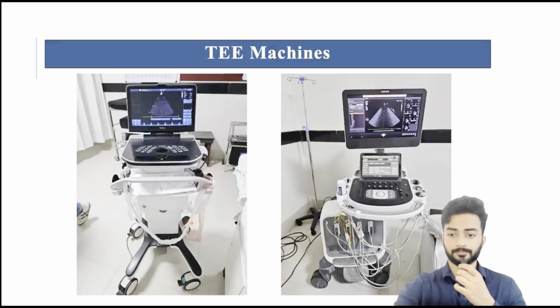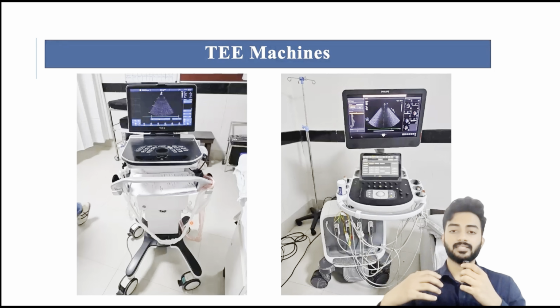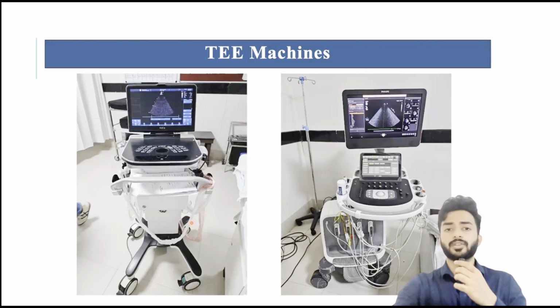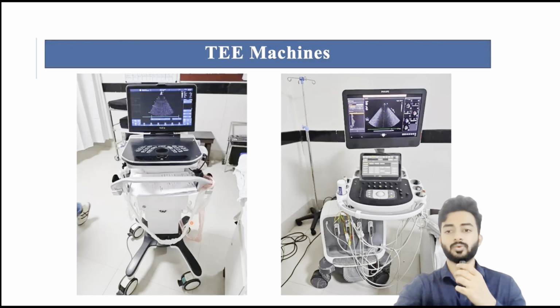So interestingly, I will tell you one fact. There was one study undertaken in the AIIMS Delhi trauma department, and they used to call us, the cardiac anesthesia residents, to put the TEE machine to visualize the emboli when they are reaming in PFN cases, etc. So we used to go there just for TEE monitoring, because other things, even the general anesthetist or the trauma anesthetist will do. Just for TEE, they used to call the cardiac anesthetist. I thought I will share this fact with you.